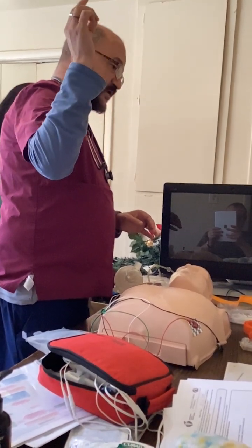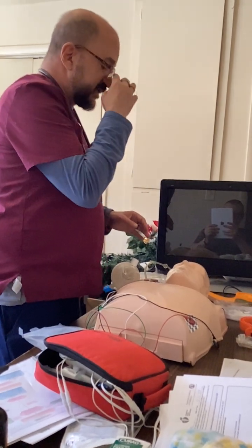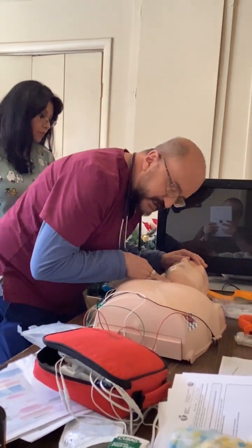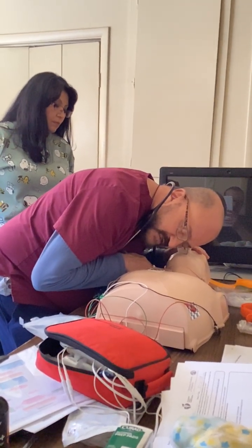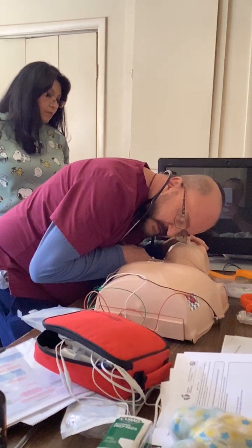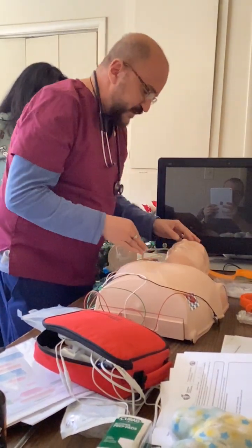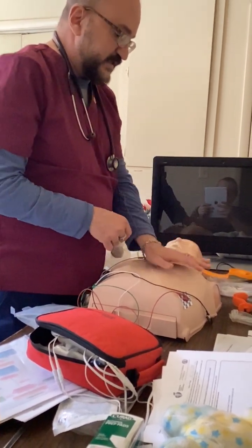You call 911, grab the AED, which you're going to bring in just a second. And I need you outside the gate for the paramedics. So I'm checking a pulse and breathing simultaneously, 10 seconds. 10, 9, 8, 7, 6, 5, 4, 2, 1. I'm going to commence compressions by myself, so it's 30 to 2. I've exposed the chest so I can see it.